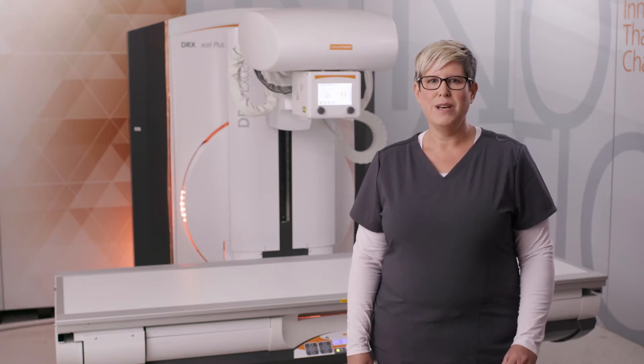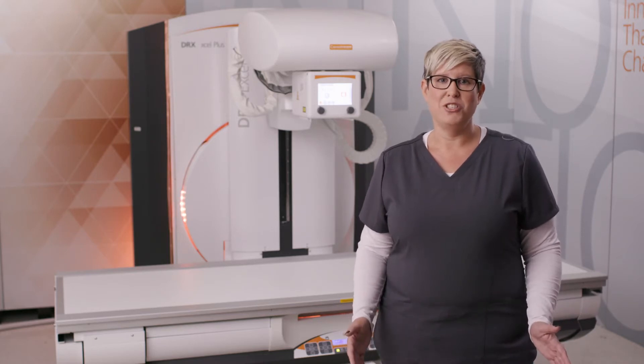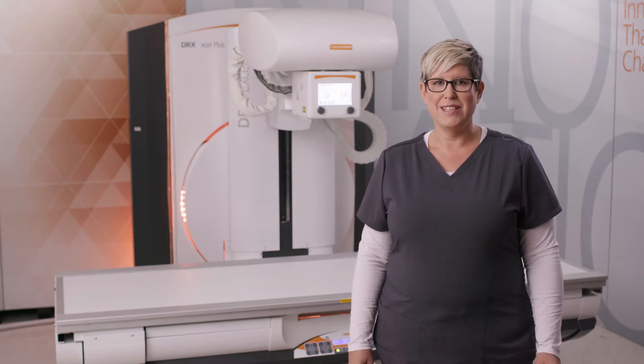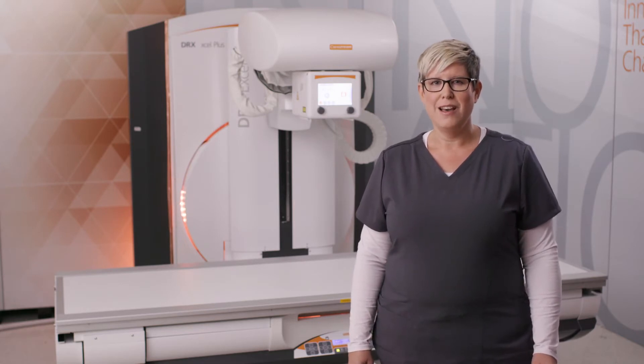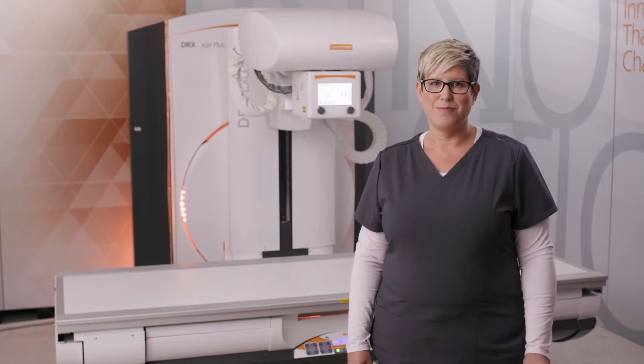Today I'll demo our CareStream DRX Excel Plus system. The workflow has been optimized by combining both fluoroscopy and general imaging capabilities in one compact unit. The result is increased productivity, high resolution images, and a wide range of exams on a single system.